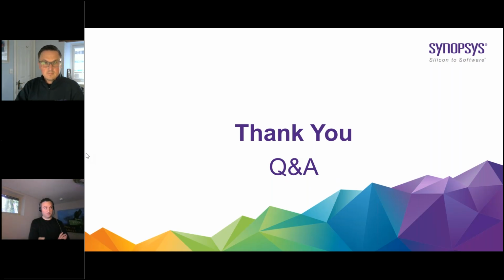And the customer who is getting the data, they need to understand. Well, we work with them. It's always a process. It's a learning process for customers. Even if they've been doing this for years, they still might not completely understand the data that they're getting and how that can be implemented within an AI tool. And it's the same old saying: garbage in, garbage out. You need to make sure the gold standard training data sets that you use are accurate and reviewed by an expert. We have clinical collaborators who can do that. Usually our customers can review the ground truth data sets to make sure those are correct. And then we can use those in the training.